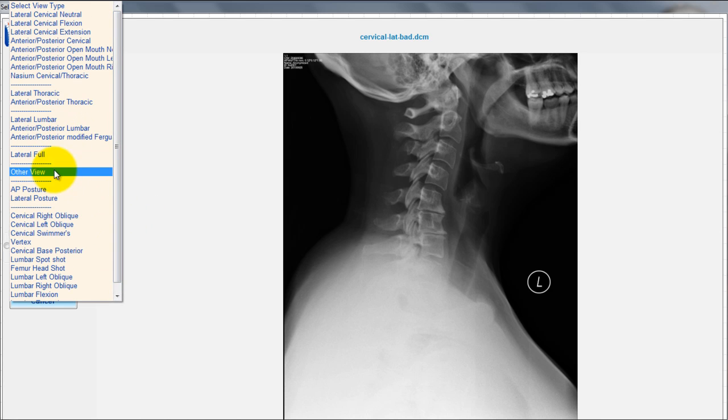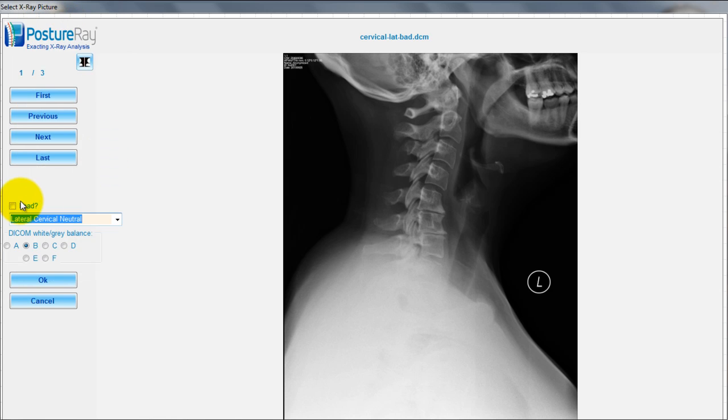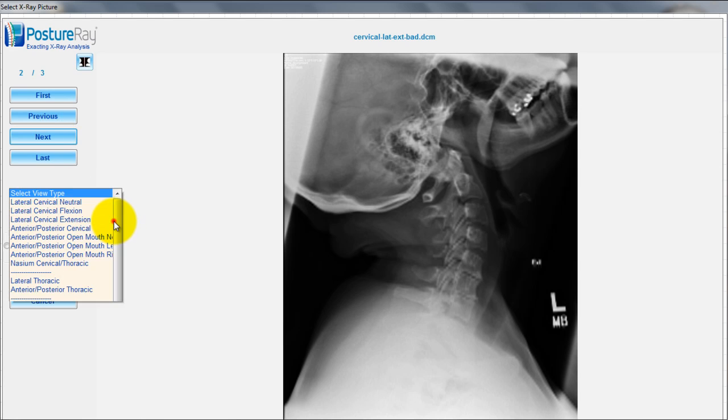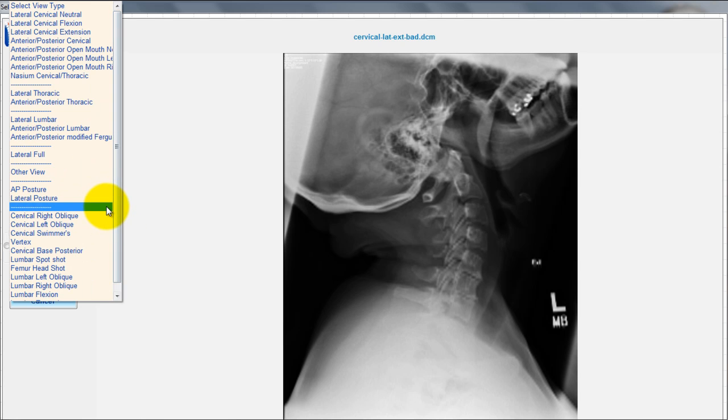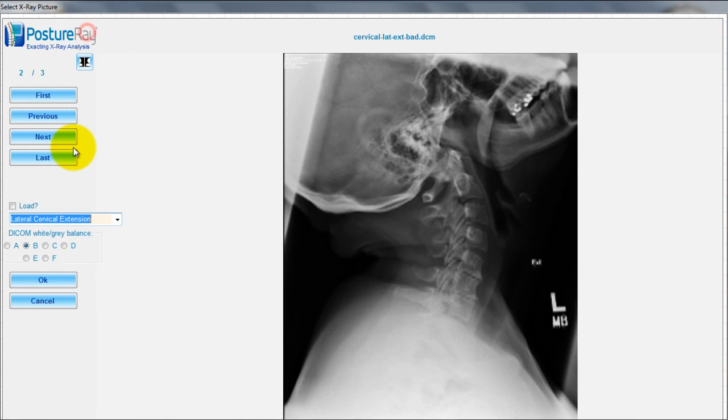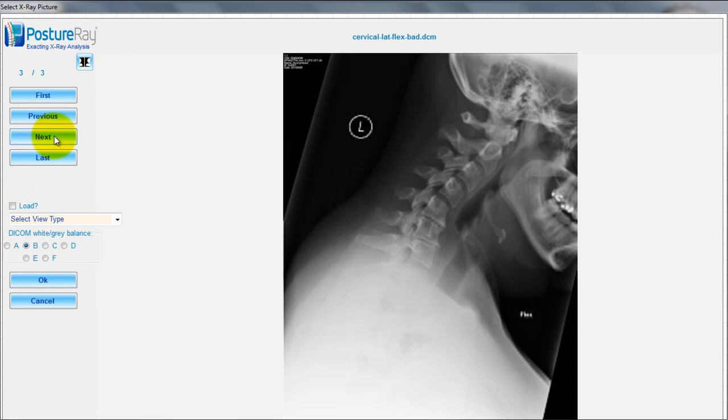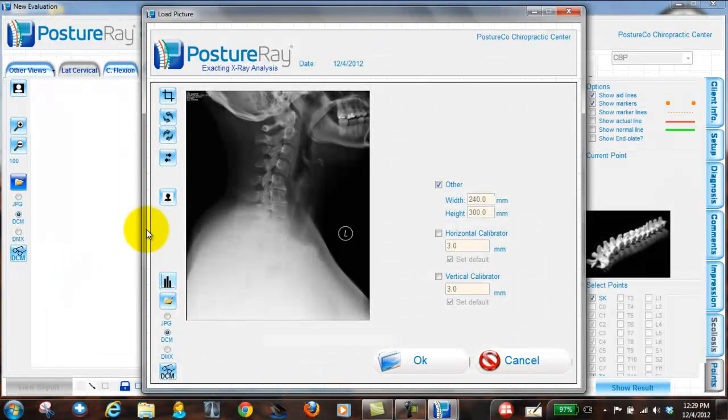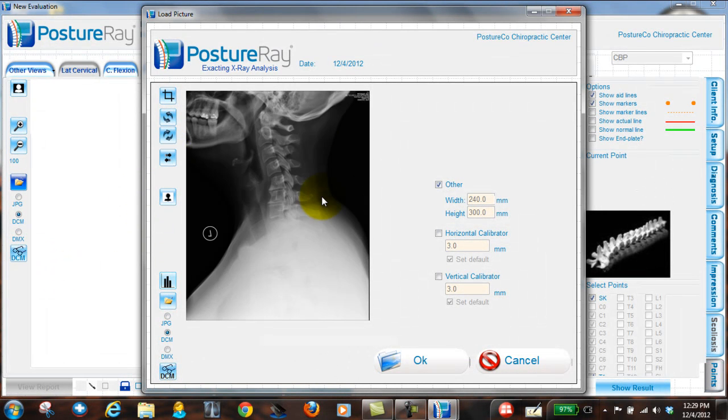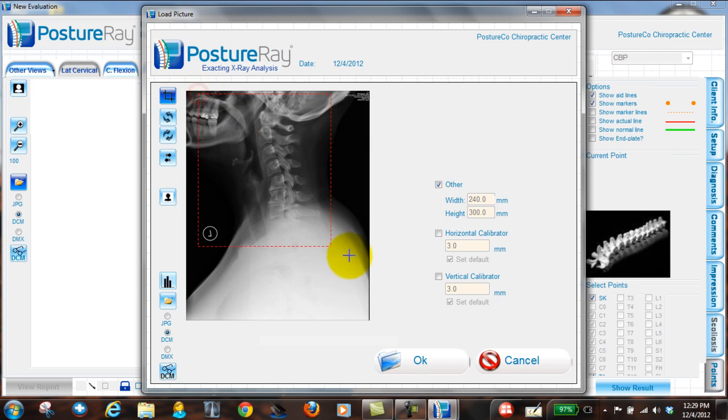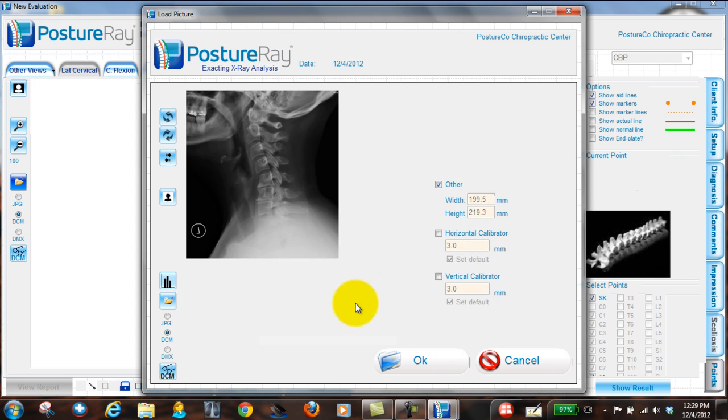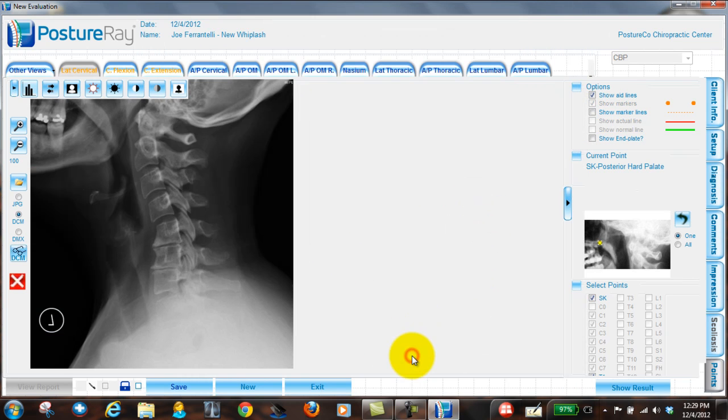So I'm going to say that this is a lateral cervical. And this is what I mean. These are images from another facility, so their compression levels are different. That's why the images, you got that choice. So let me go ahead and do an extension. Even though this is not my X-ray, I'm just walking you through a mental process on how this works, what your staff will do. And when this is done, now what did I say about the anteriors? We always face to the left.